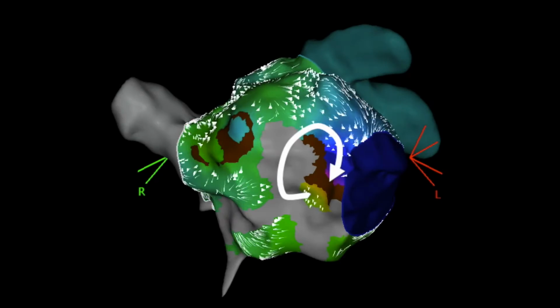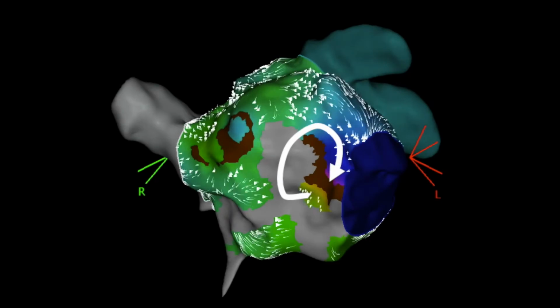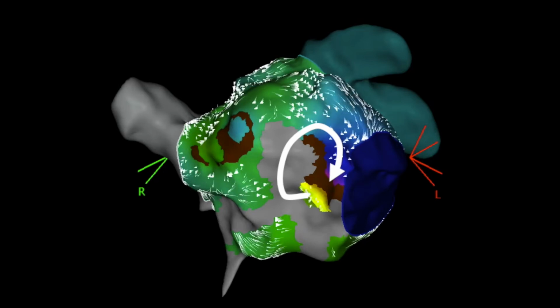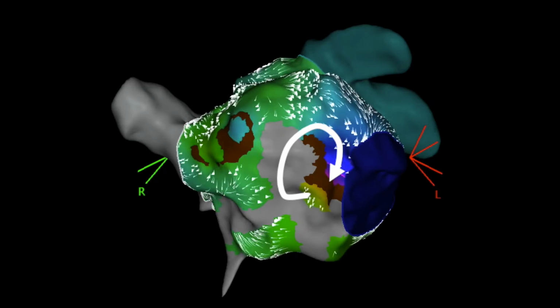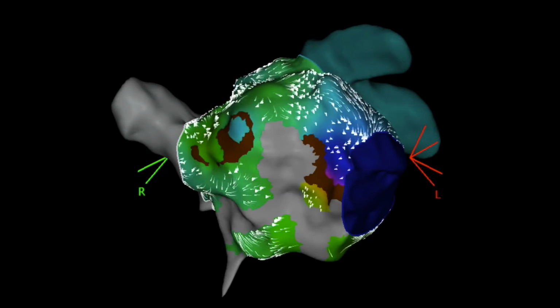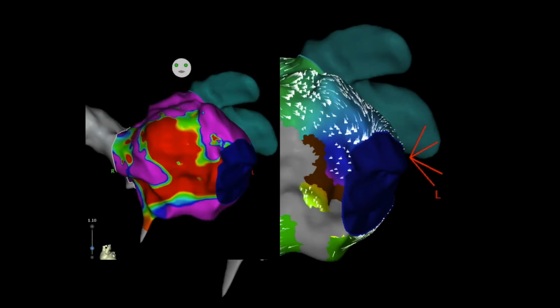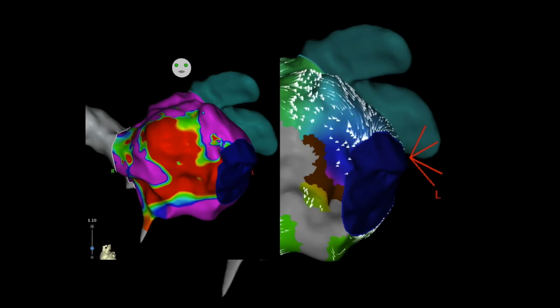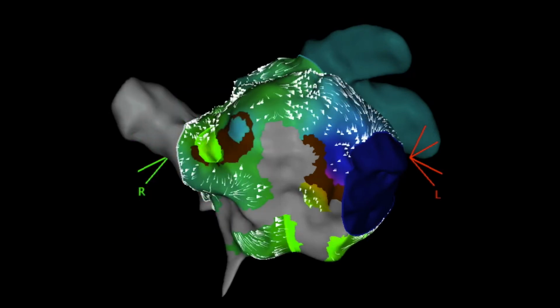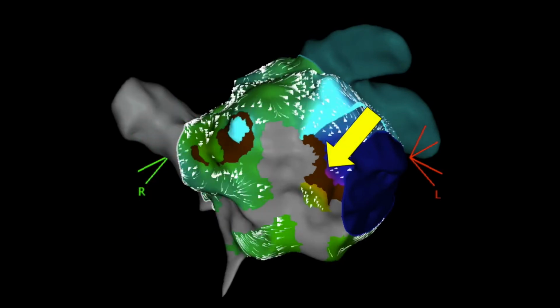Focal source atrial tachycardias are common after AF ablation, accounting for up to 55% of all post-AF ablation atrial tachycardias in different series. Among these, localized reentry, as in our patient, is the most common atrial tachycardia mechanism, in one study representing 75% of focal atrial tachycardias.